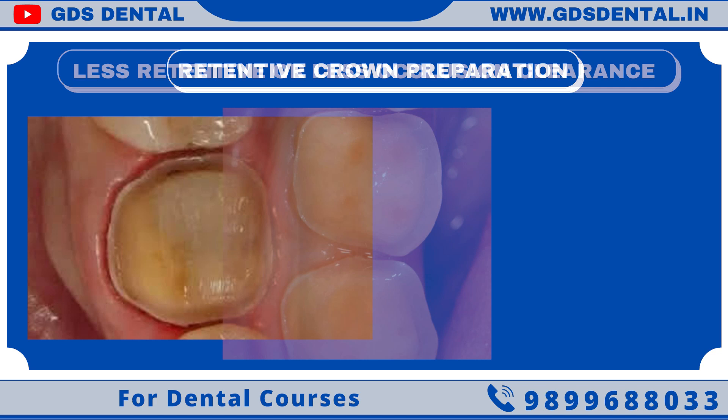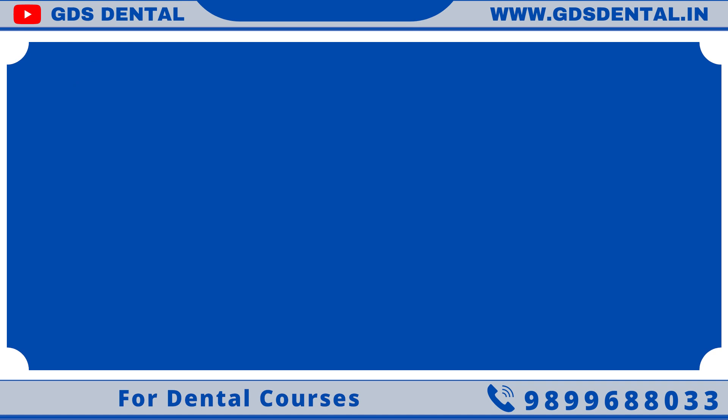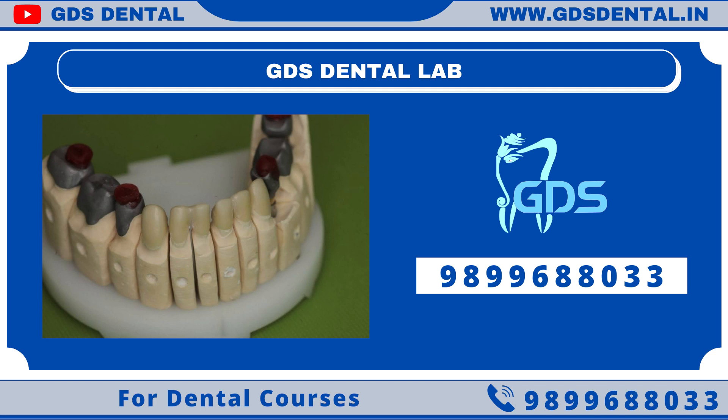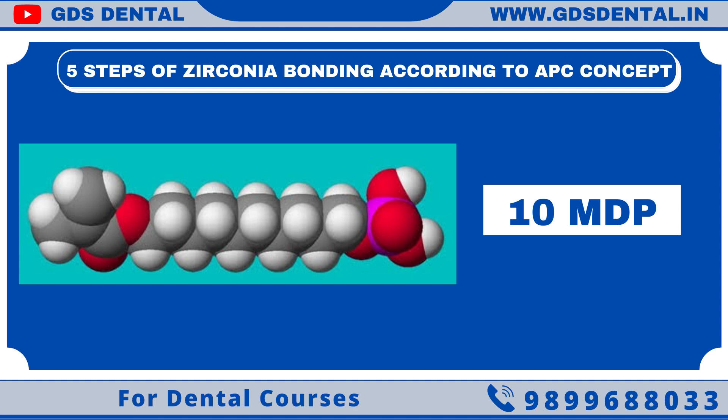But if your zirconia crown doesn't have retention, or it is thin and weak due to less occlusion space, then we have to bond zirconia to tooth. In order to have a successful restoration, your lab plays an important role. If the zirconia restoration doesn't have a close fit, then your restoration will fail. For bonding zirconia, we have to follow 5 steps according to the APC concept. 10 MDP is key to bonding, as it can chemically bond to both tooth and zirconia.